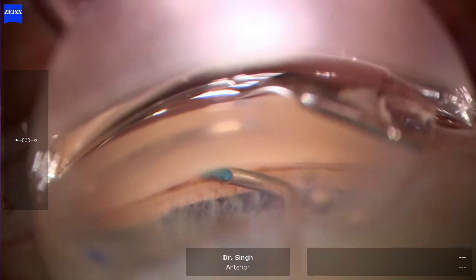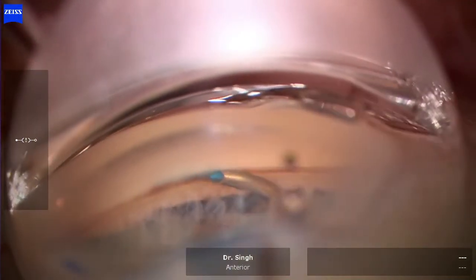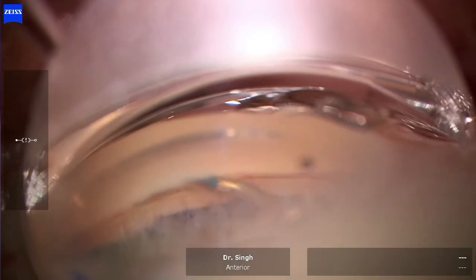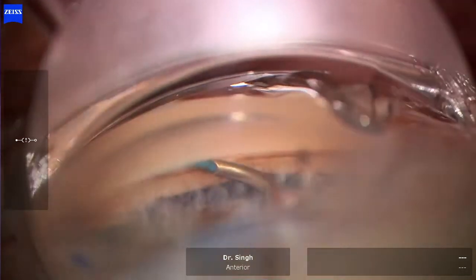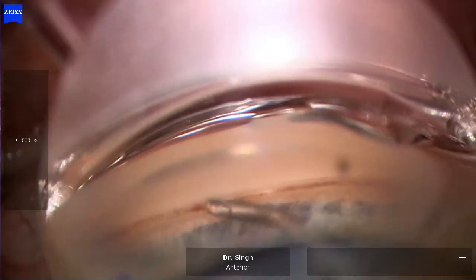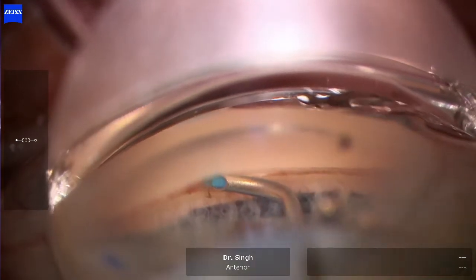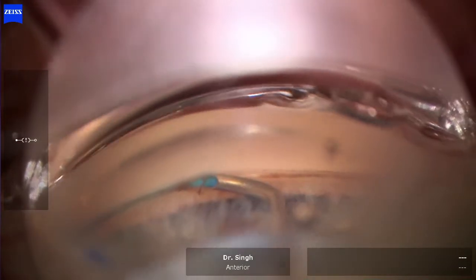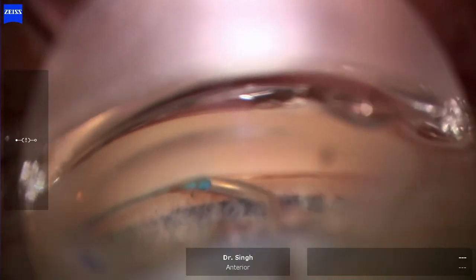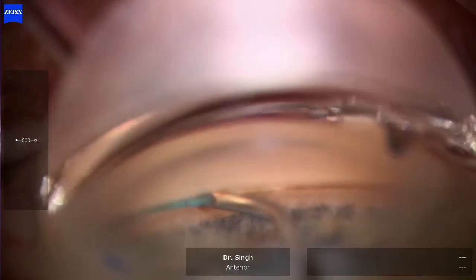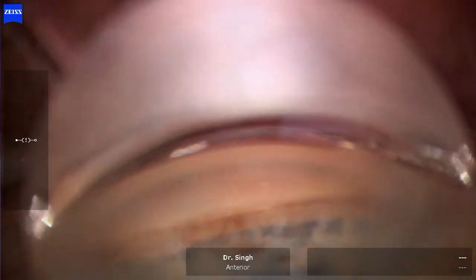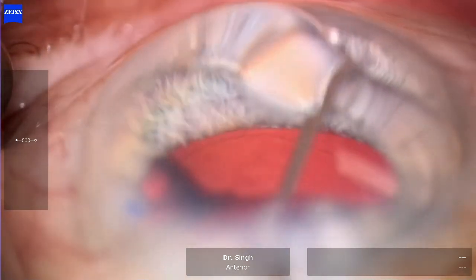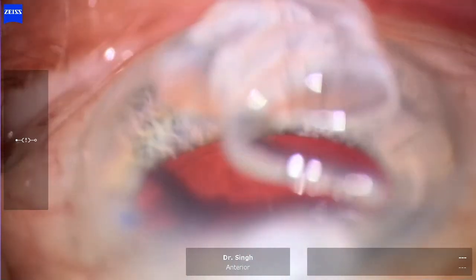I'm feeling resistance, I'm going to re-engage — still feeling that resistance. It's not how much pressure I'm putting; it's the angle of approach. It's too acute. I'm going to go downstream a little bit, flatten my approach angle, and now look — it just slides in beautifully. The catheter is going into Schlemm's canal. I'm advancing the wheel until it stops, then retracting it back, releasing the viscoelastic into the canal and hopefully into the distal collector system as well. The issue was the angle of approach, not the pressure.